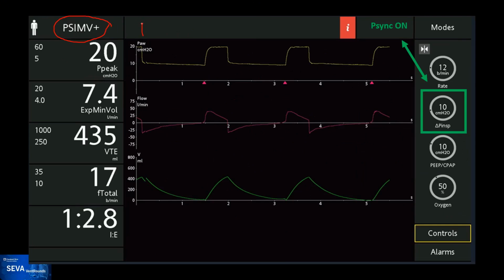Yes, type 1 is the original type, whereby you set a mandatory breath rate and you're going to get that rate no matter what the patient does. IMV type 2 lets the ventilator look at the spontaneous breath rate, and if that spontaneous breath rate is higher than the set mandatory rate, then it will not deliver mandatory breaths. The mandatory breaths are suppressed by a high spontaneous breath rate. And the reason why you want to do that is you want to get the mandatory breaths out of the way if you don't need them, because the patient will have better control over the timing with spontaneous breaths.